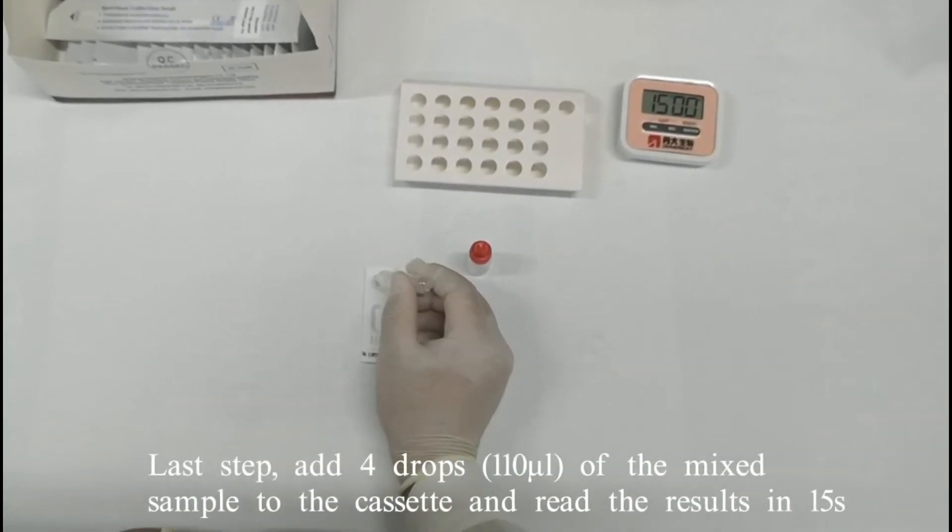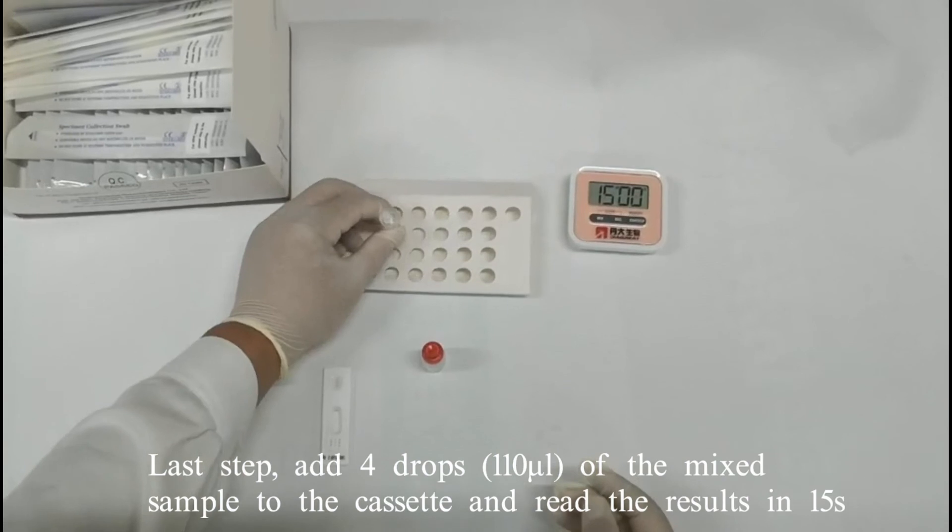Last step: add four drops of the mixed sample to the cassette and read the results at 15 minutes.